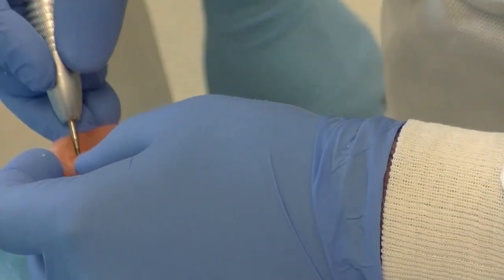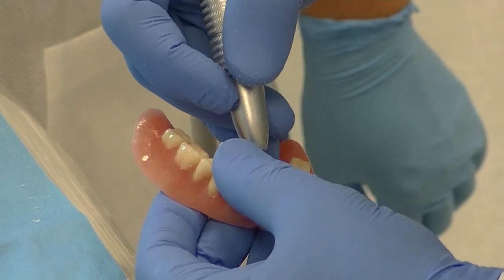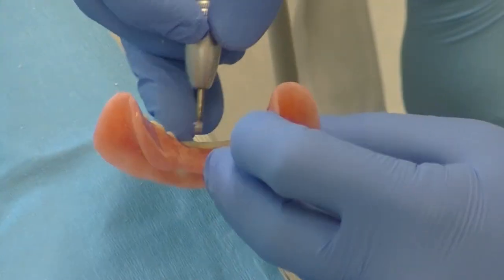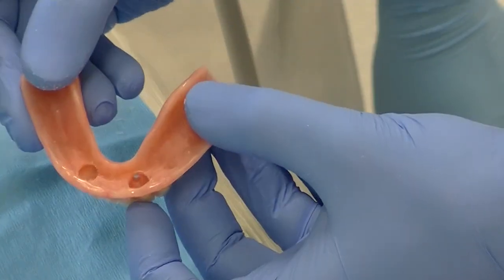Additionally, you can take an inverted cone bur and create additional mechanical undercuts on the intaglio surface of that relief chamber. As you can see, I want to see holes punching through completely on the lingual slope, allowing the material to easily vent out the lingual slope surface.